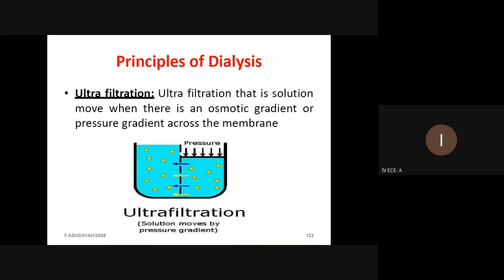Then dialysis is nothing but an artificial kidney. It performs the functions of a kidney to maintain the pH level in our body. Then the defibrillator. Whenever we have a fibrillation, we have to use the defibrillator. Defibrillation plays an important part during a medical emergency or cardiac arrest.